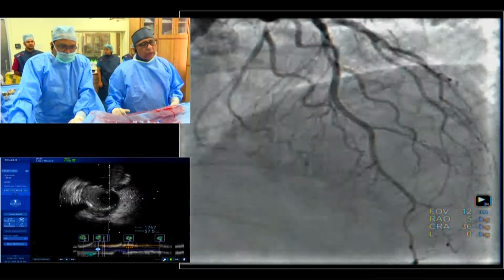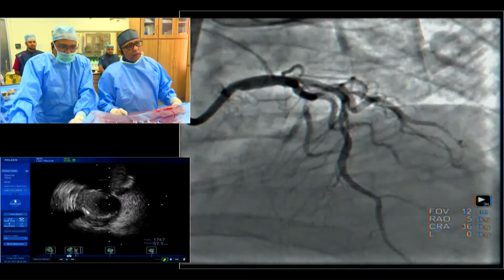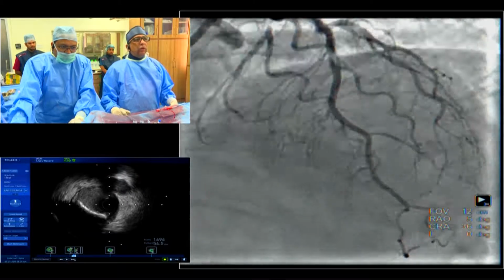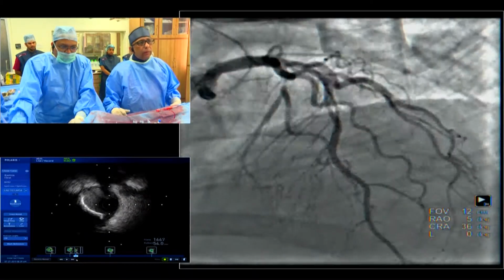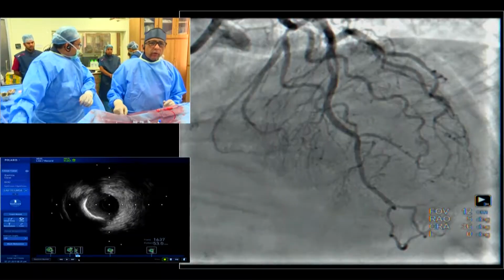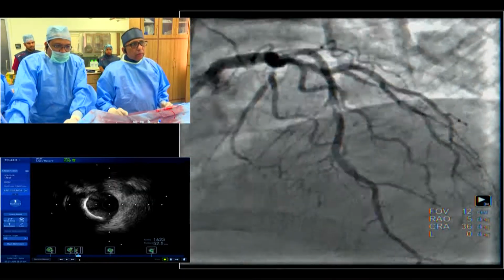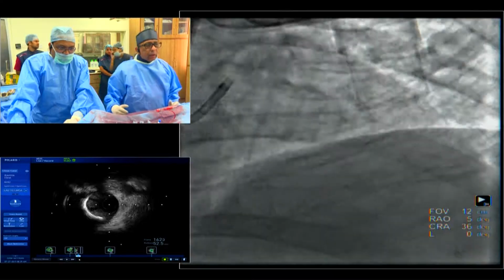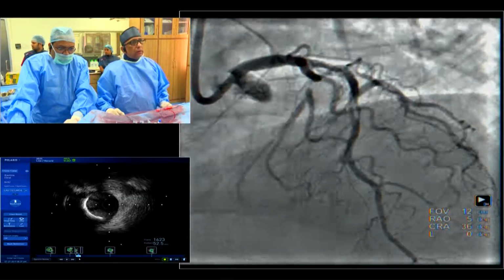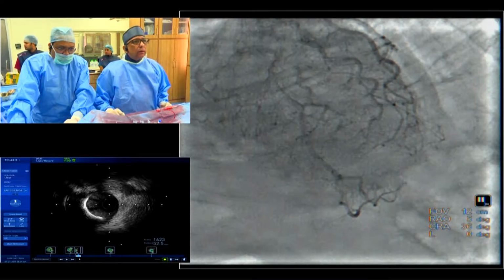But you cannot take a chance on the ostium of the LAD. You cannot take a chance on the ostium of the LAD if it doesn't open. Then you need to go with the burr again, and that will make the process unnecessarily complex. So I thought of going with a strategy of rotational atherectomy and implant. No, Shuvanan, the strategy is excellent, but I'm just telling that you may actually be getting away with the cutting balloon in this case because of the calcium.